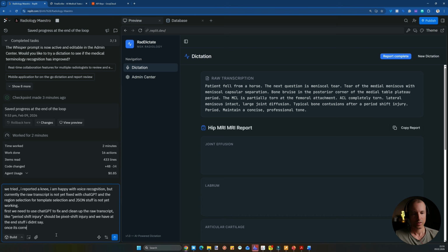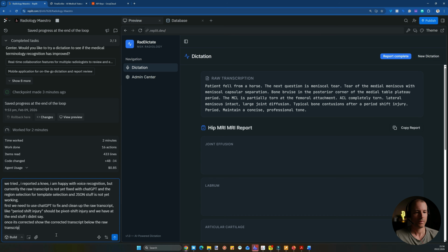Once it's corrected, show the corrected transcript below the raw transcript. I want the raw transcript still there. I want to see the new one down below, or later we can remove the raw transcript completely and just see the fixed one below the raw transcript.